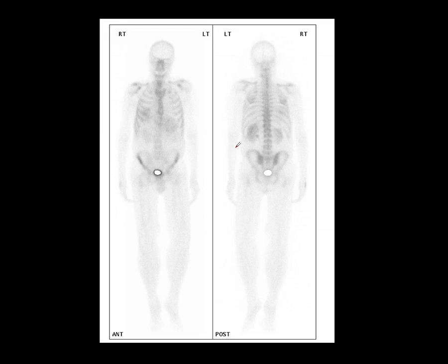And when divers go down, they just see barnacles sitting on the cannon and the ship. The calcium accumulates in the intracellular structures, and then the radioactive tracer will accumulate on those. So potentially any damaged dystrophic tissue can take up methylene diphosphonate, and we can see them on our scintigram.